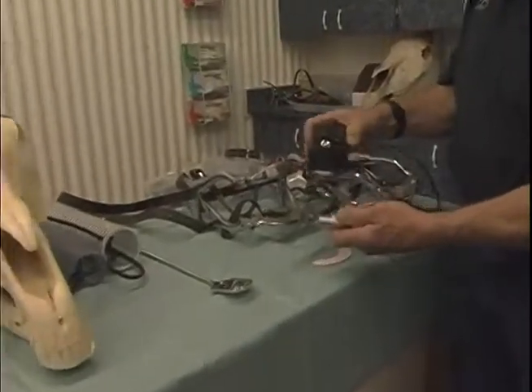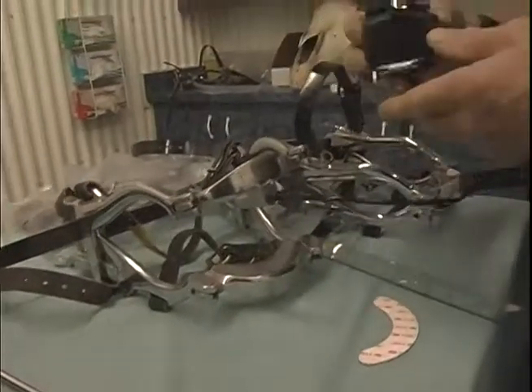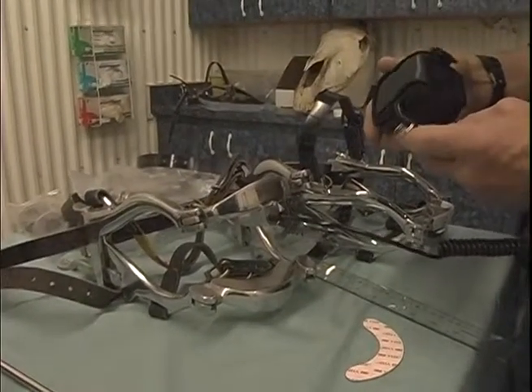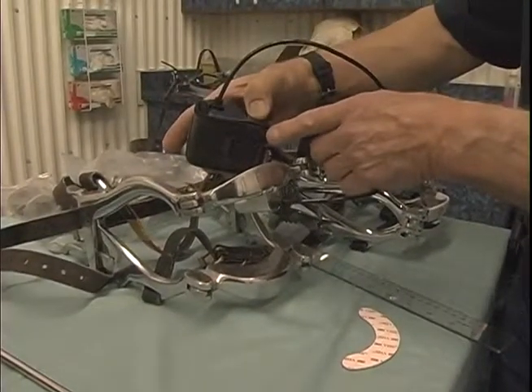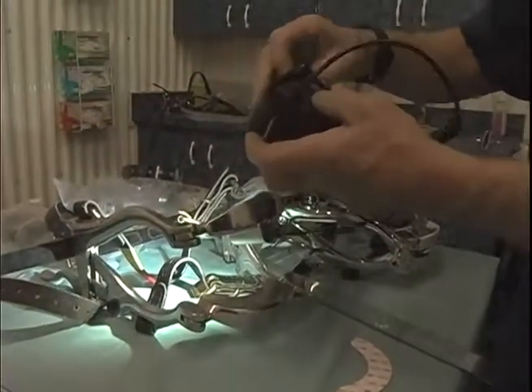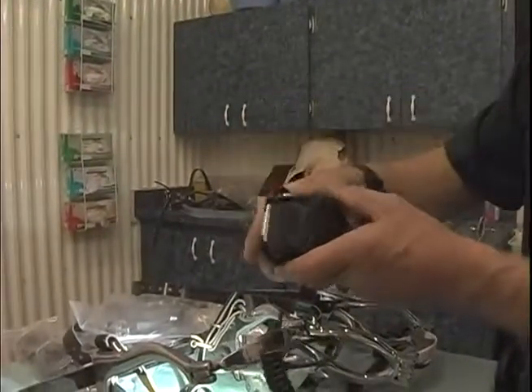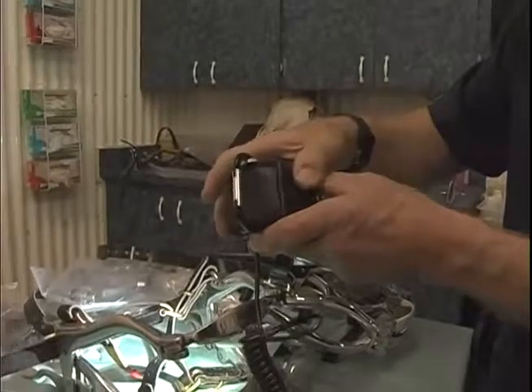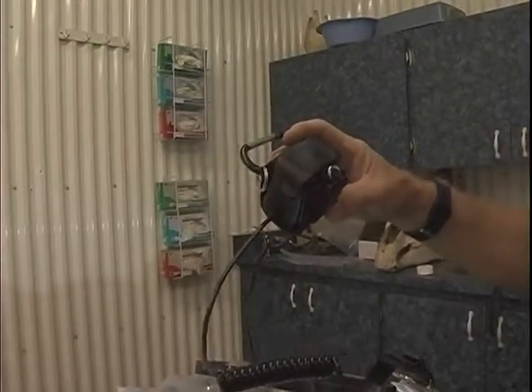The power light, which we use, as previously mentioned, sits onto the upper incisor plate with a magnet. The power source has 6 AA batteries, and it is clipped onto the dental halter above the horse's head with this clip, this carabiner clip. Some people will clip it on the side of the speculum, but we prefer that it's clipped up on the dental halter.